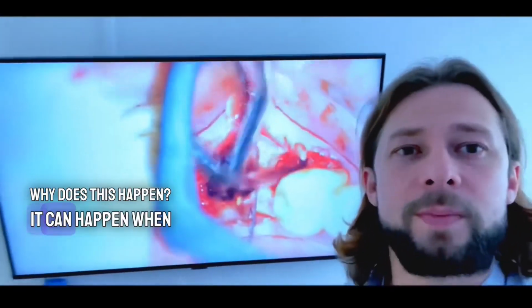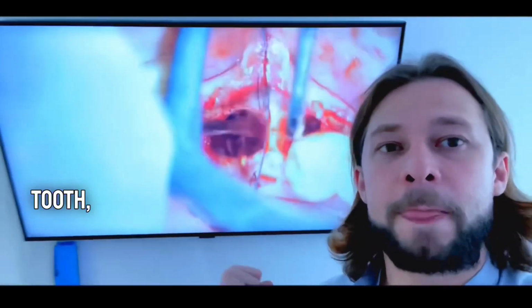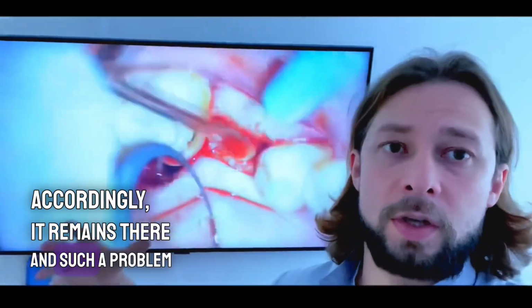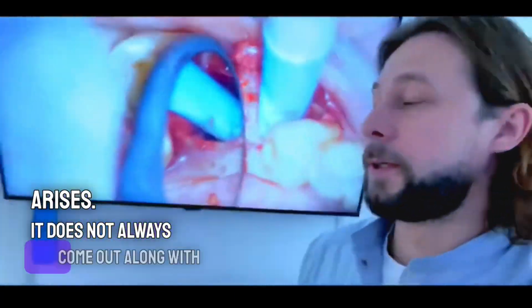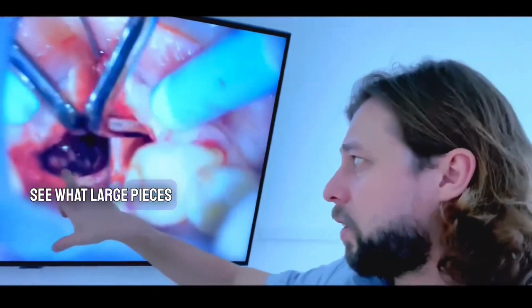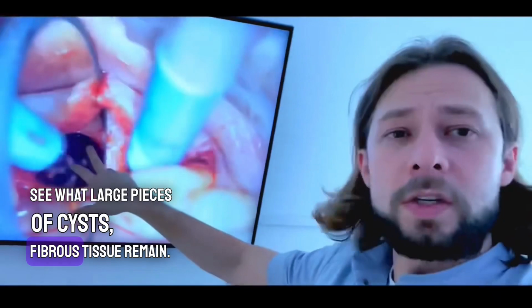Why does this happen? It can happen when after removing the tooth, the cyst is not completely removed. Accordingly, it remains there, and such a problem arises. It does not always come out along with the root of the tooth. Here we observe this very much. See what large pieces of cysts and fibrous tissue remain.